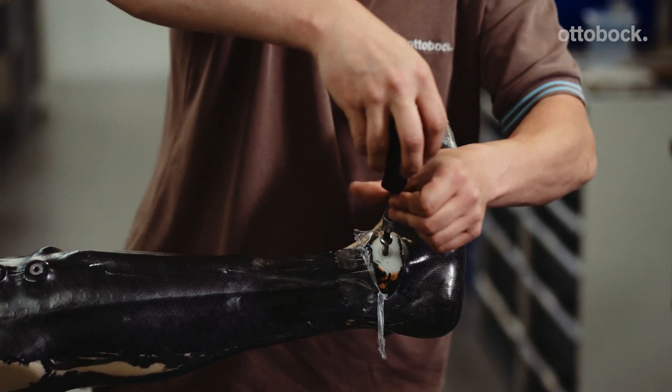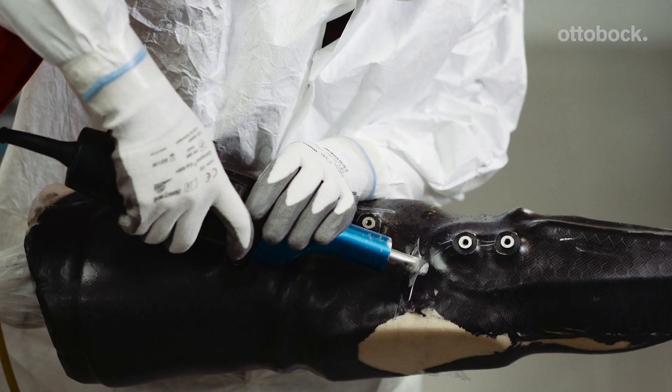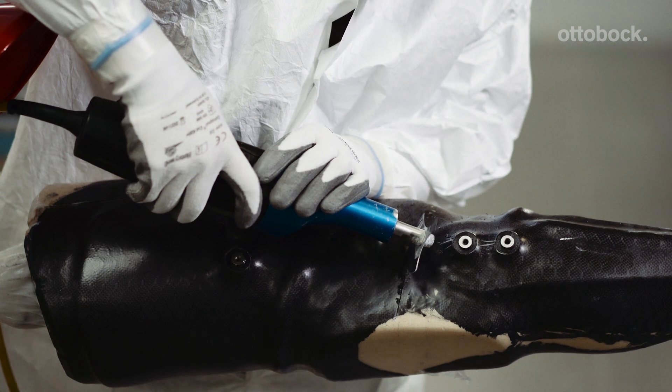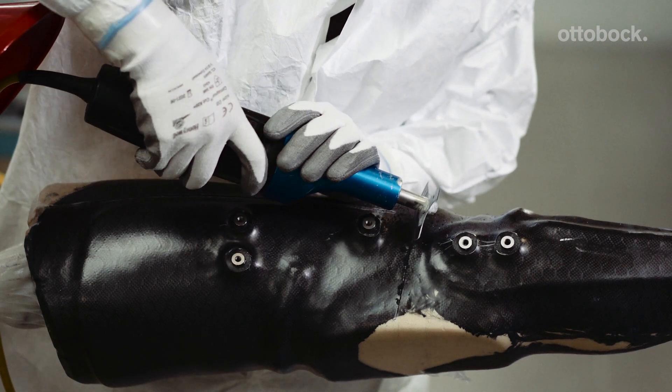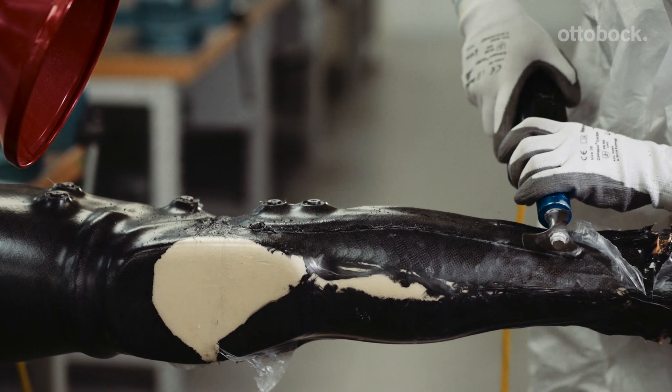Remove all screws from the ankle joint dummies and joint alignment adapters. Use an oscillating saw to expose the orthosis shells. Make sure you saw through the inner shell at the level of the knee joint.